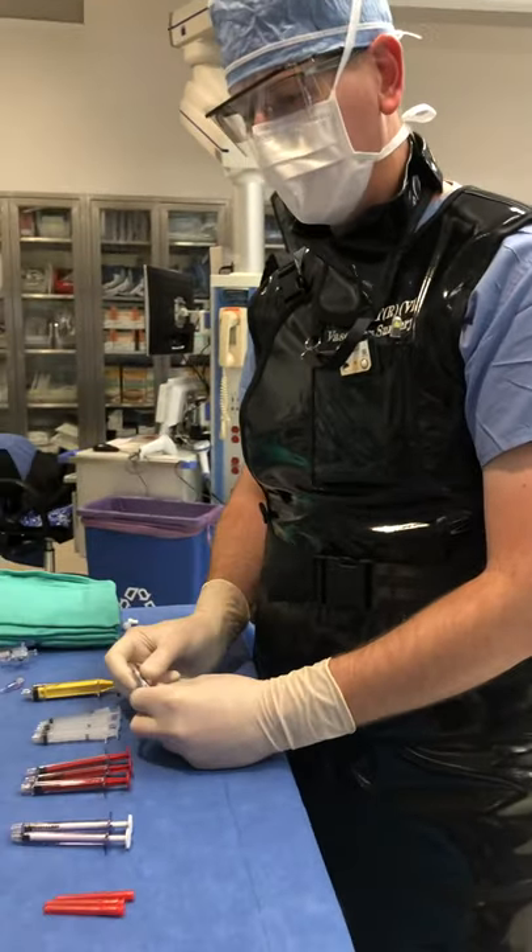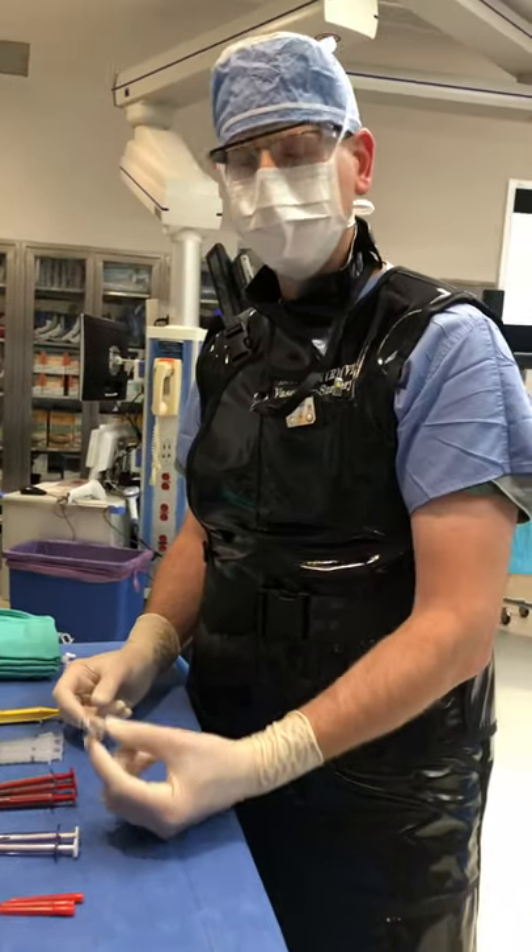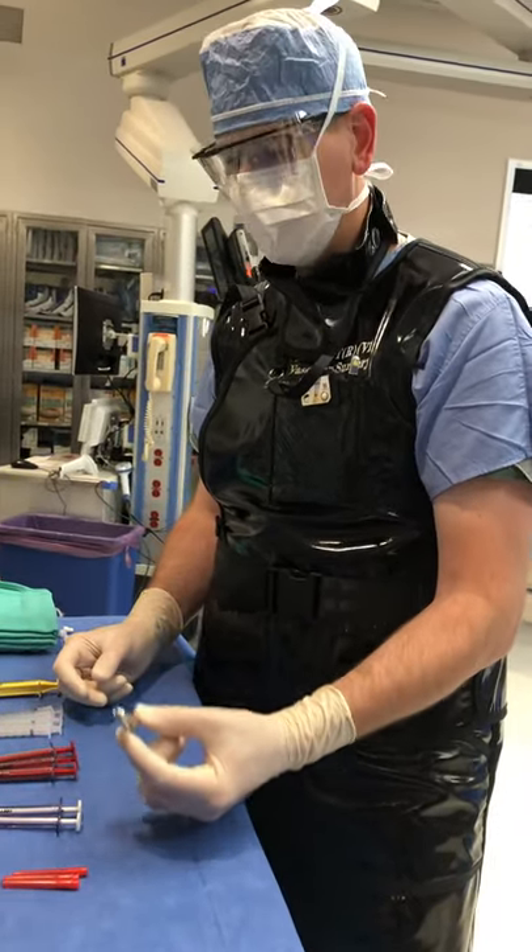Hello, this is the way that Dr. Roy Greenberg would always do his glue embolizations, and I think it's a very good way to learn and do it safely.